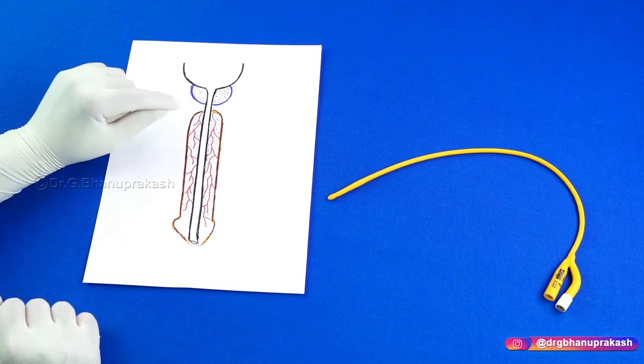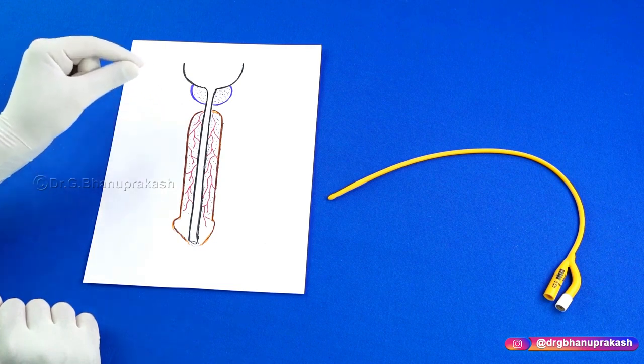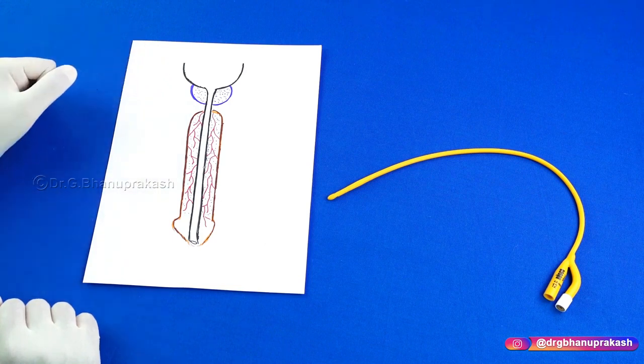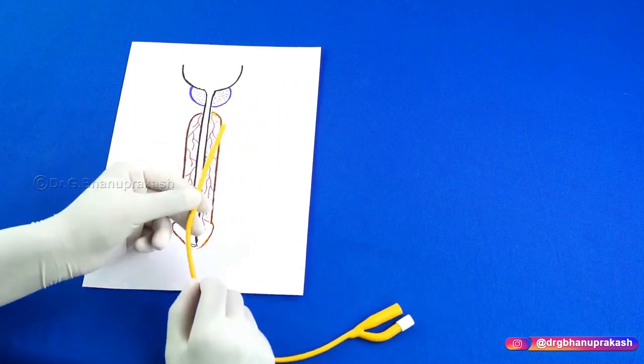Mind you, the membranous part of the urethra is the weakest part of the urethra, which is more and more prone to trauma or damage. Point number 1: you take a Foley's catheter.